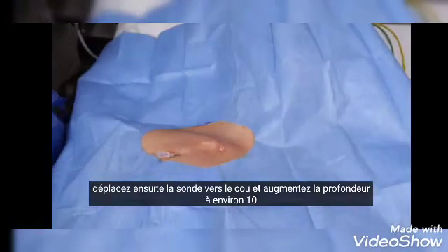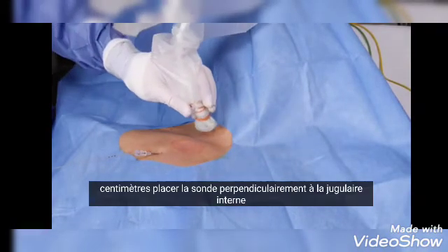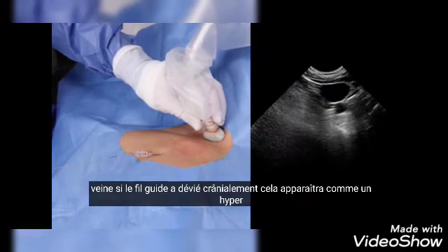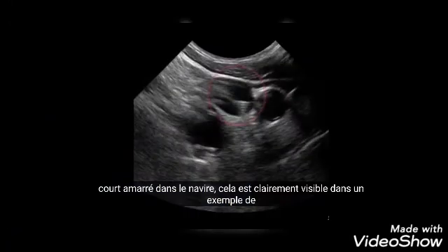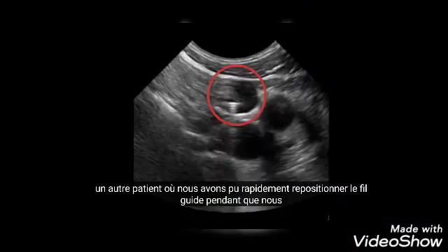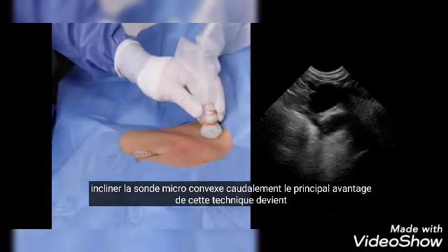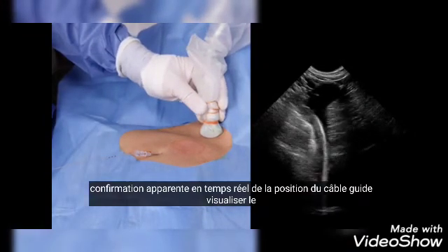Next, move the probe to the neck and increase the depth to about 10 centimeters. Place the probe perpendicular to the internal jugular vein. If the guide wire has deviated cranially, it will appear as a hyperechoic dot in the vessel — clearly visible in an example from another patient where we were able to promptly reposition the guide wire.